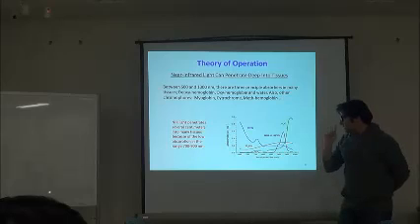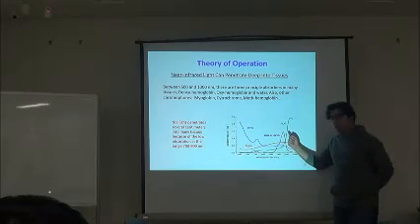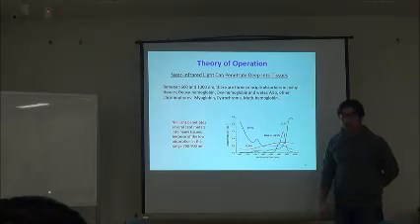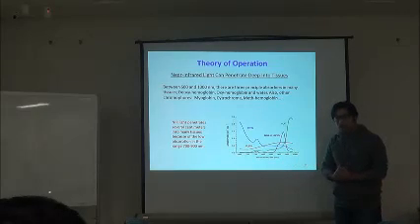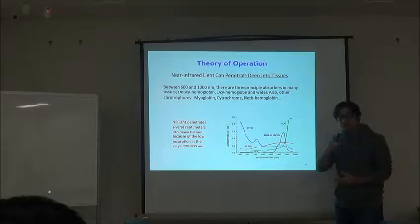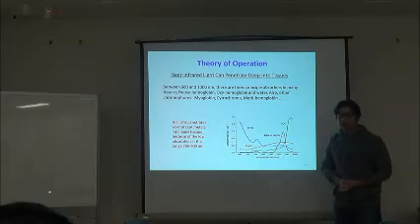Now, your question is that some people really want to use a third wavelength to measure the water. That's a good thing to do, because in that case, using three wavelengths, we will have three unknowns and three equations, and we can actually measure the absorption due to water. And that absorption we can subtract from the original values to remove the error, to remove the noise, because water is like a noise in our case.